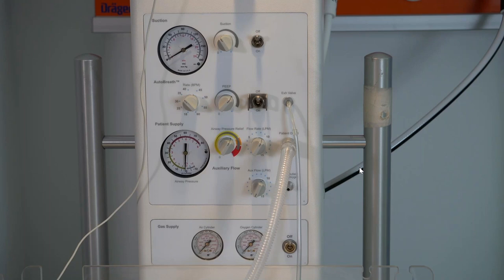Okay, the next question. How do you set the rates? Can we explain how do we set the rates on the resuscitator? Linda, would you like to take this question, or how would you like to comment on this? I think it's best you deal with it, except to say that generally we would start the rates off quite low if the baby's breathing by itself, and just observe. So give a support of maybe 20 and see where you go from there. But it's open for discussion because at 20 that might be all the baby needs if it's breathing in between.